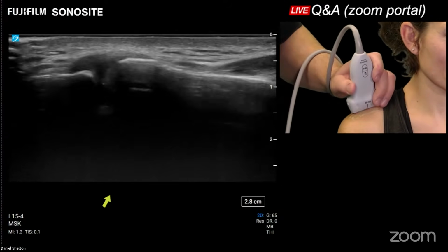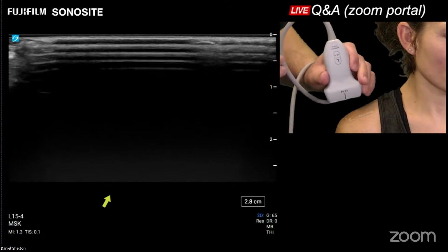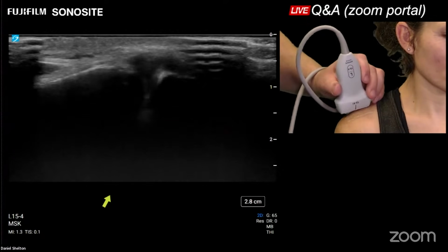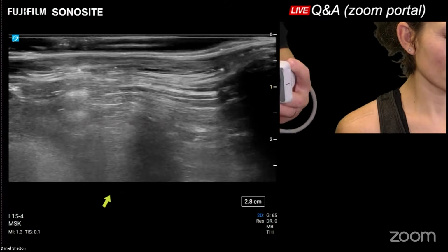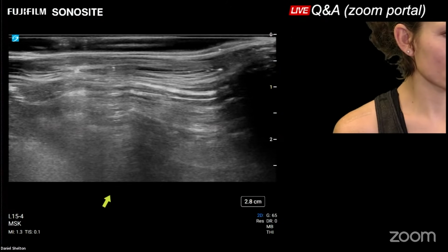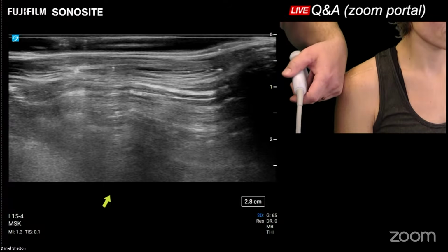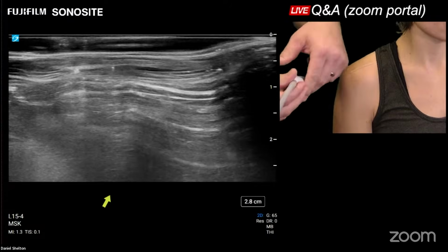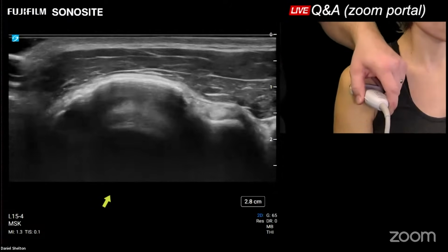Yeah, just as a whole, as we wrap up the rotator cuff protocol, I think it's good to go over those highlights of the shoulder while we wait on any of these other questions to come in. So we might as well back that camera up just a touch, and we'll take a sweep around the rotator cuff fairly quickly, starting at the biceps. And if anybody has any questions, feel free to let them come on in.